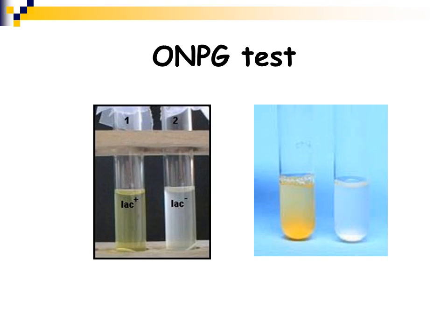Now, there are some organisms that are late lactose fermenters, and you know that there are selective and differential media that will allow you to identify lactose fermenters. But if it's a late lactose fermenter, it may not turn color within the overnight incubation. So you might miss a late lactose fermenter, which is why the ONPG test is nice, because it allows you to see those late lactose fermenters. Again, this test is not manually performed in the clinical lab any longer, but the instruments that are used in the clinical lab will do the ONPG test.